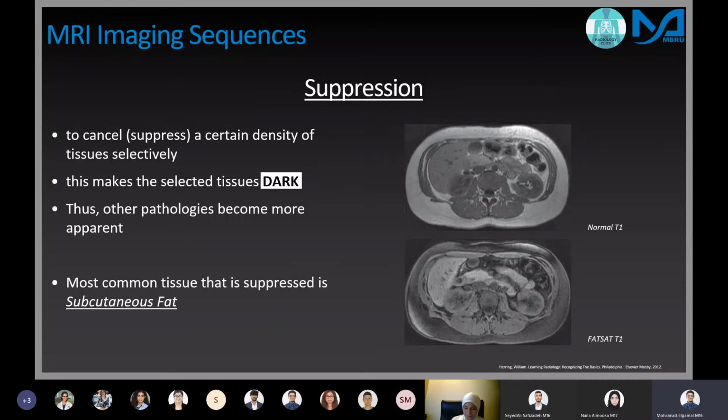Moving on, another important thing that the computer does for the MRI is that if you can see here in this image, the one I'm showing you guys, you can see that most things are around the same color. They're all around almost the same shade of white or gray. That's because they're all more or less around the same intensity, but they're different tissues.